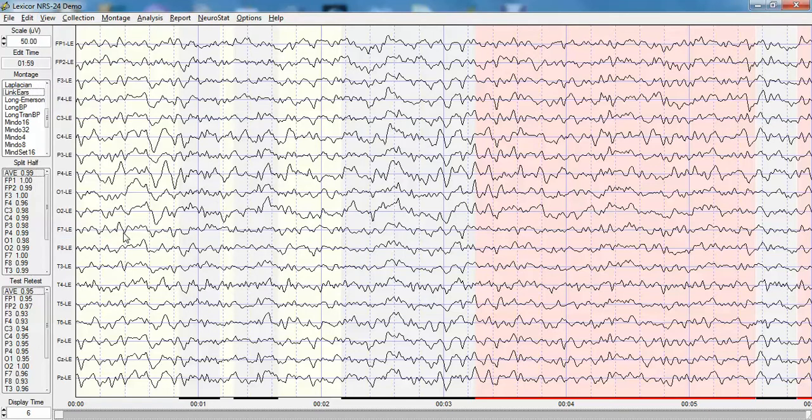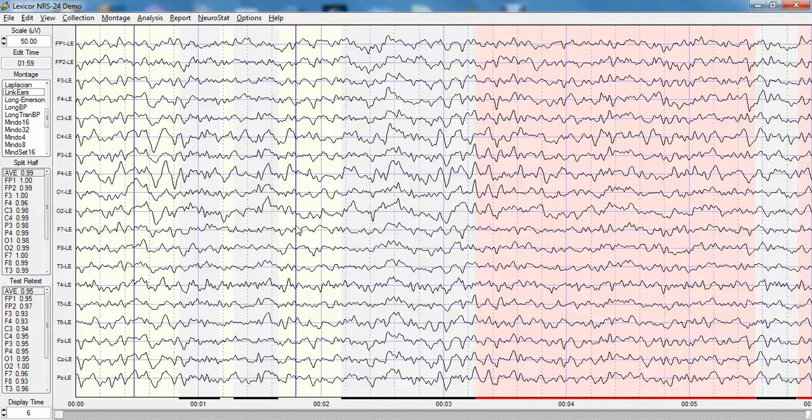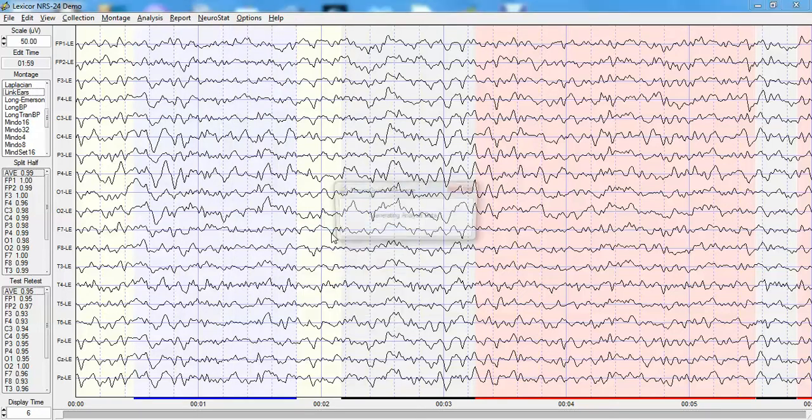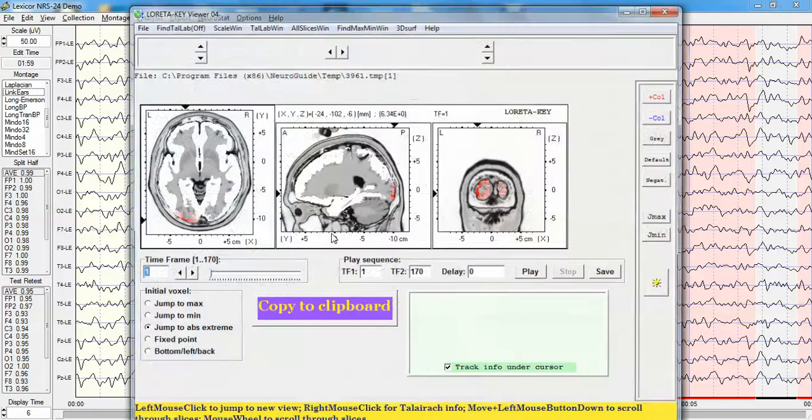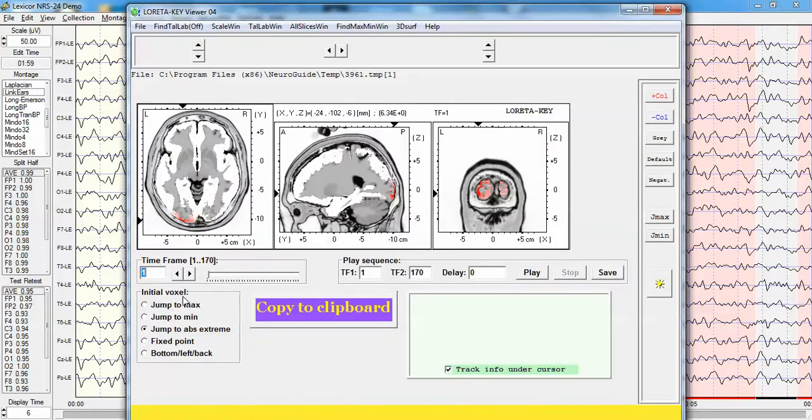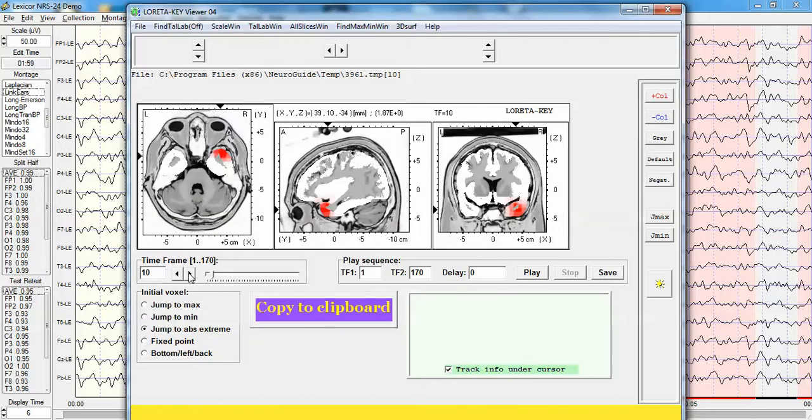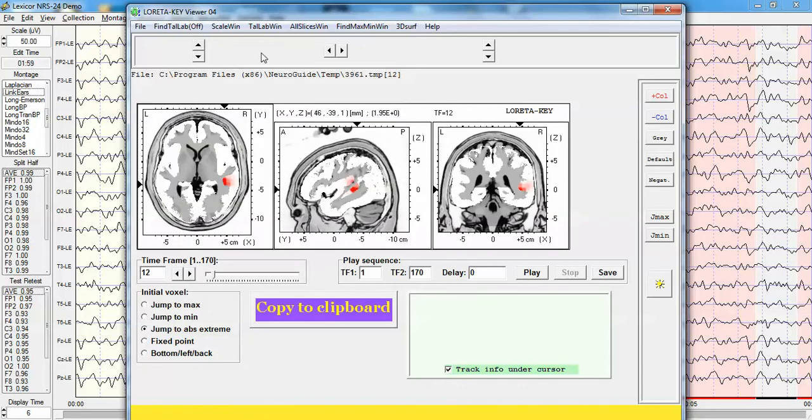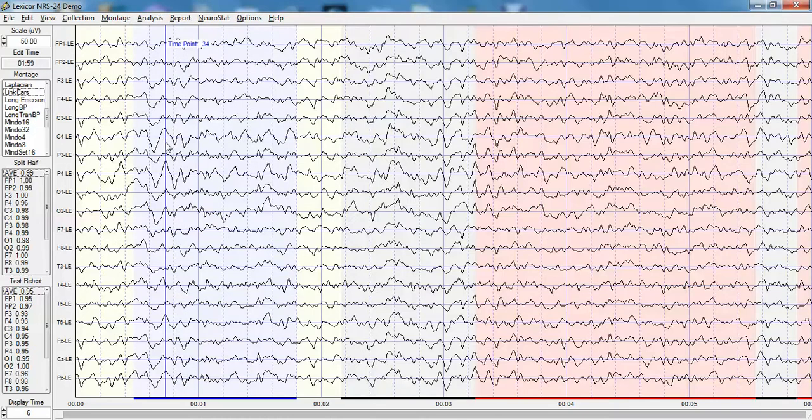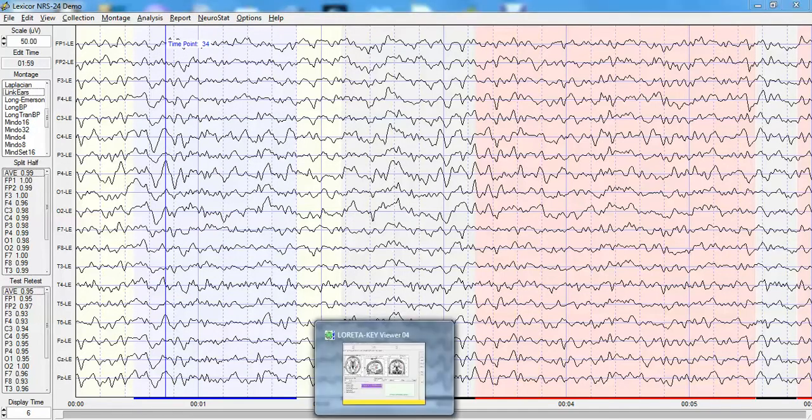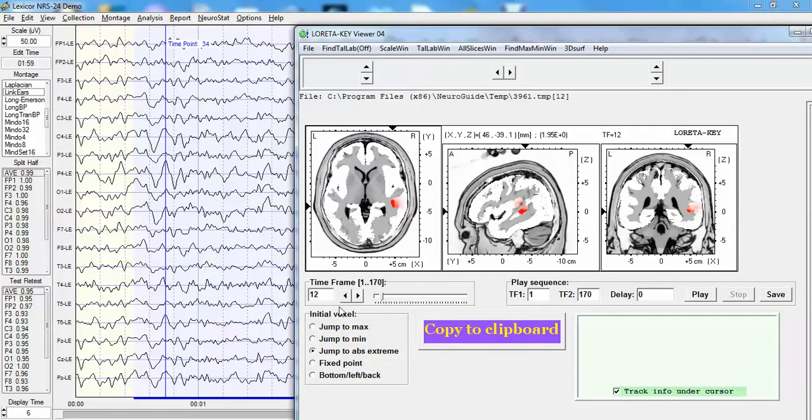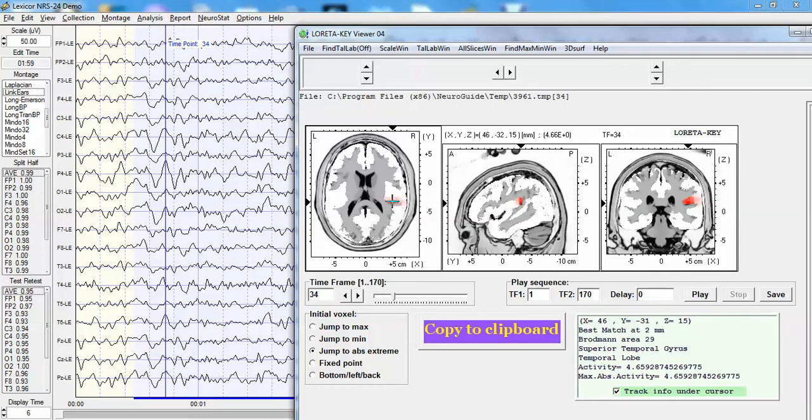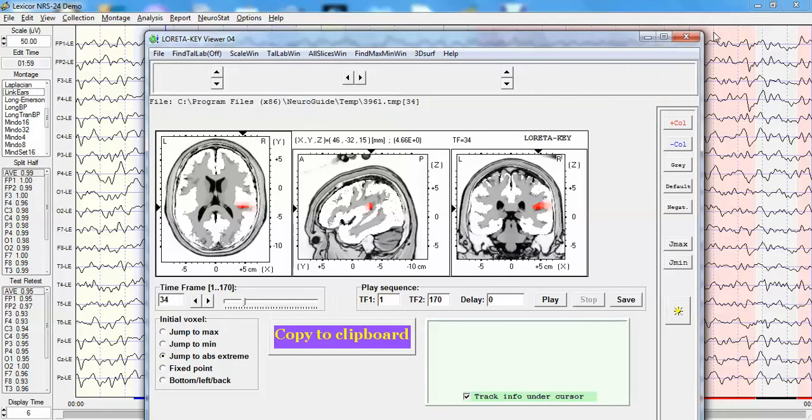For example, that allows you to evaluate particular peaks, launch the LORETA viewer from the Key Institute, and then evaluate the time domain Z scores that are existing for a given part of the record. Let's say this part here at time point 34, we can determine where that particular event comes from, which is the right parietal and temporal region where this patient had been injured.